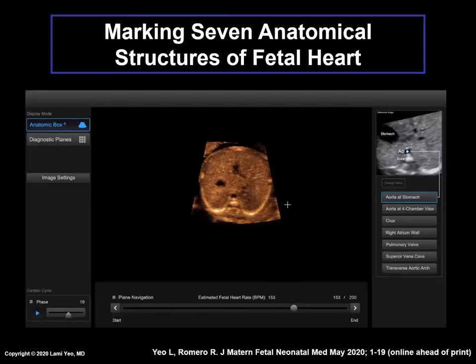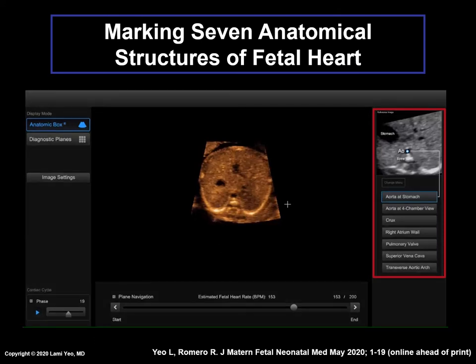The Anatomic Box panel is on the right-hand side of the screen. This video shows the marking procedure. Please note that when we say marking, this means placing the cursor on the anatomical structure, which is the same as clicking on the structure.